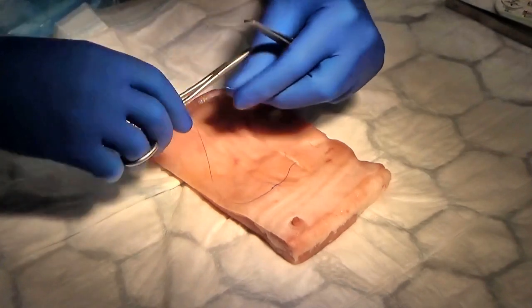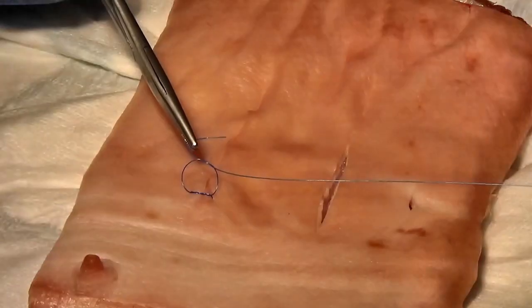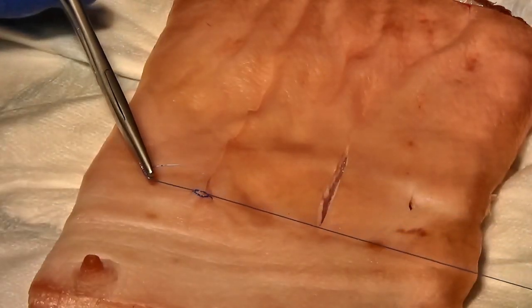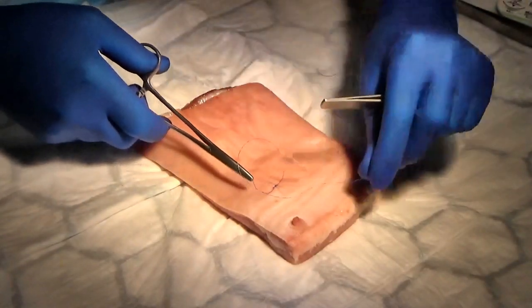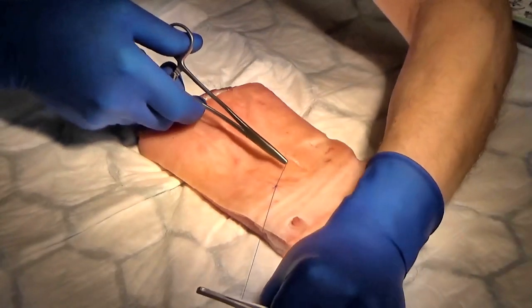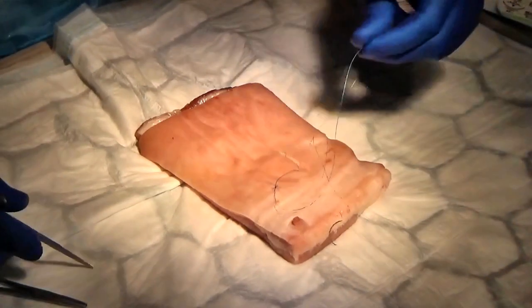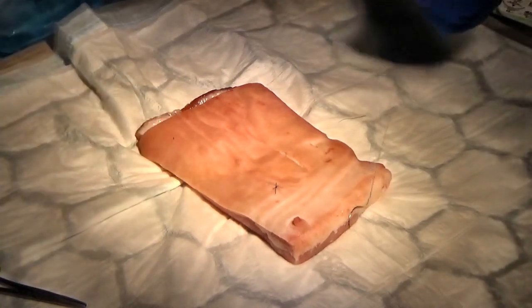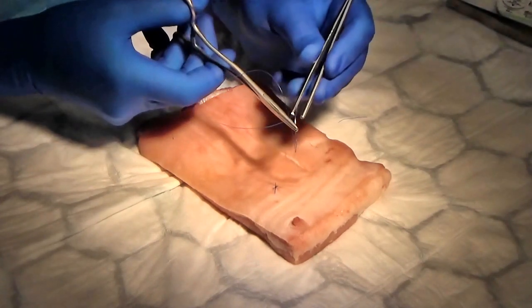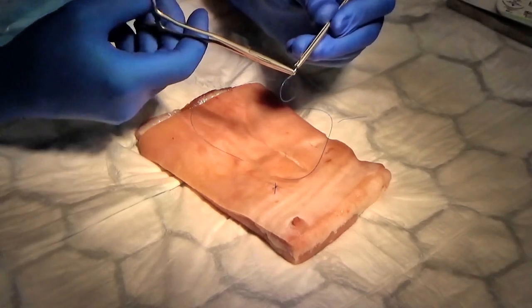You then go back anti-clockwise, and then one throw again clockwise. Then you need to cut your suture. Okay. Handling your needle again, do it with forceps, not fingers.